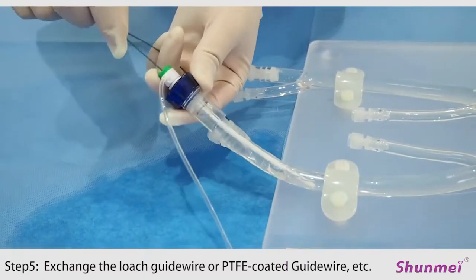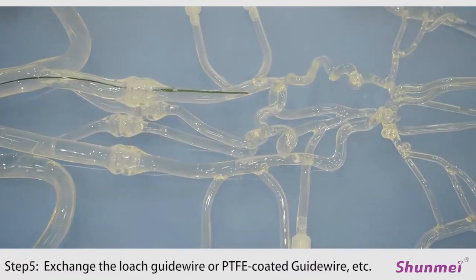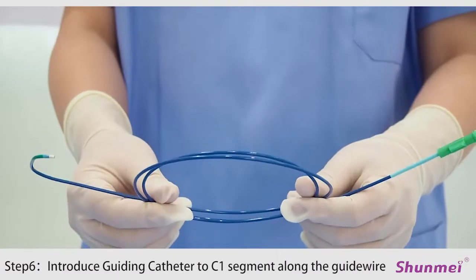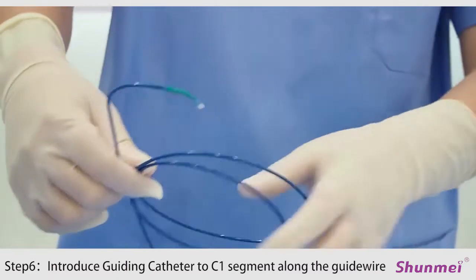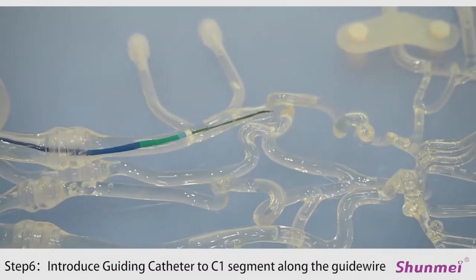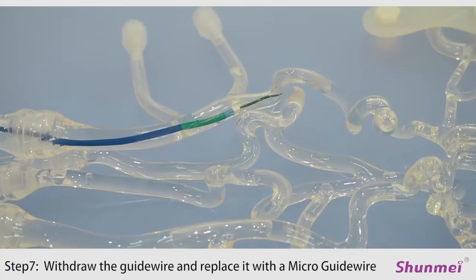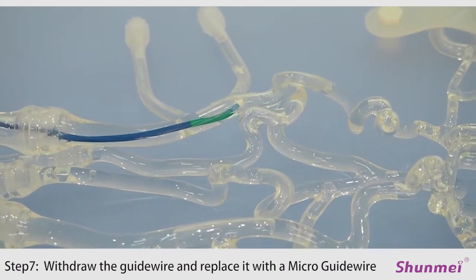The guide wire is introduced into the body through the introducer sheath and continues to go up to the internal carotid artery. Then, the guiding catheter is inserted. After the PTFE-coated guide wire is in place, the guiding catheter is introduced along the guide wire and up to the distal position of the C1 segment of the internal carotid artery.